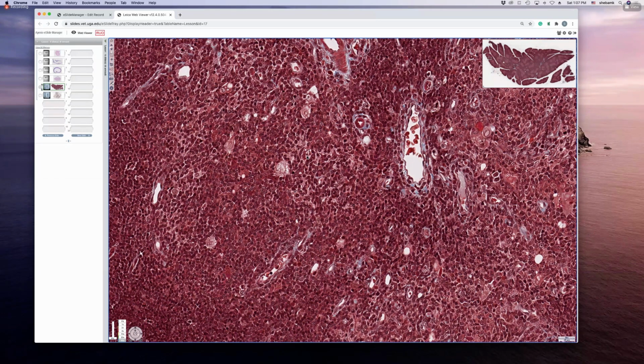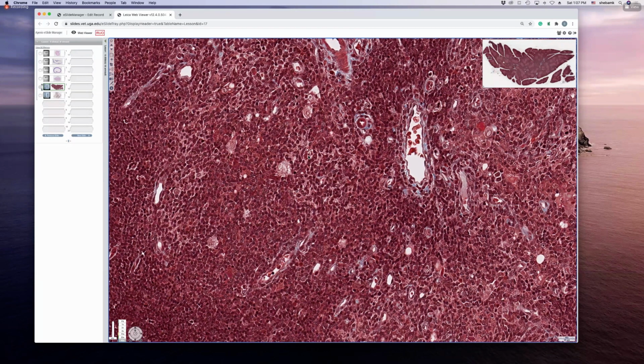What kind of fibers do they produce, first of all? Reticular fibers. Can you see them with H&E stain? No, you cannot. You have to have special stains to see those fibers. Usually silver stain works the best. Epithelial reticular cells produce very little fibers actually.